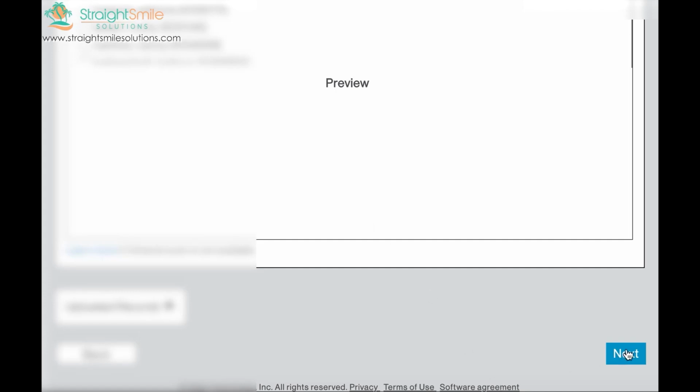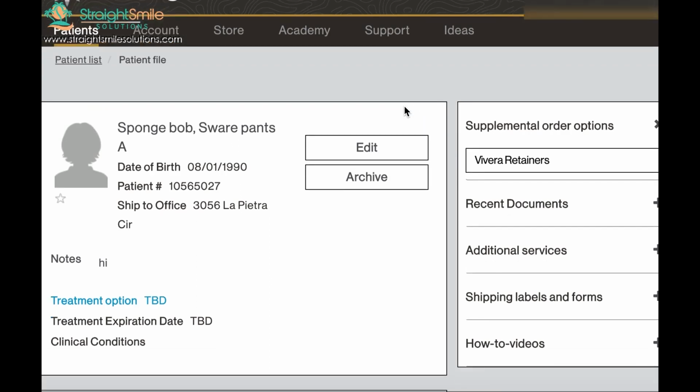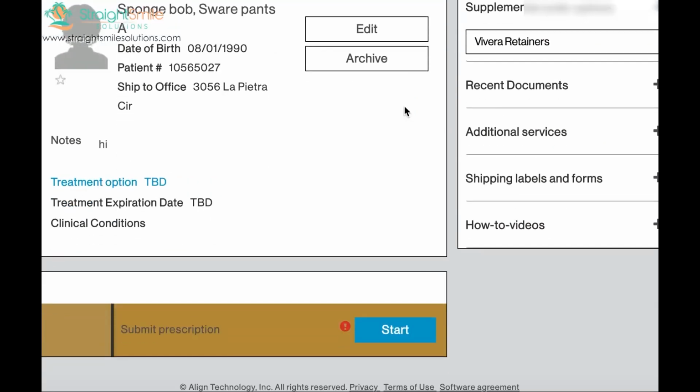I wish that Invisalign would change things. I think that it's not cool. I mean, I'm pretty out there about it. I realize that they make a scanner and they want you to buy their scanner. They claim that it's not as accurate, but I've seen thousands and thousands of aligner cases, maybe not Invisalign cases, but with your Medits, your Hurons, all these other trios, and they're fine. Come on. They're smart enough they can figure out how to make this happen and not upset patients. I think that was a big mistake, but we won't get on that soapbox right now.